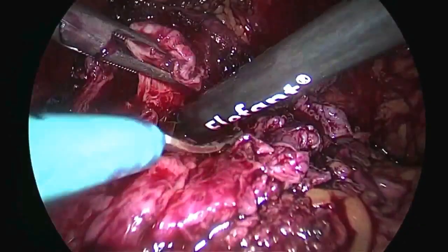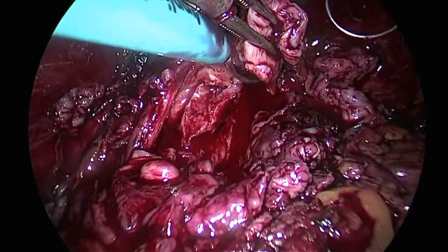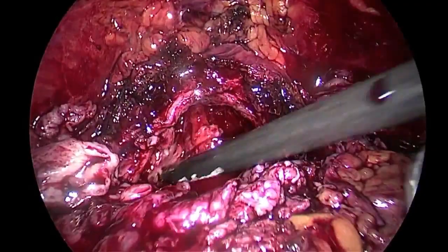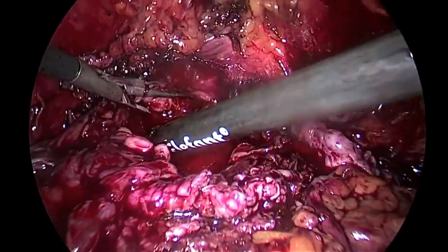Francesco. Yes, tell me. In terms of bleeding, you think there is no more bleeding than the standard technique? Standard technique, what means standard technique? Endoscopic, yes. So if you have a bleeding, I think that you need to control the bleeding. Can you give me another stitch, please? To control the bleeding, hopefully.